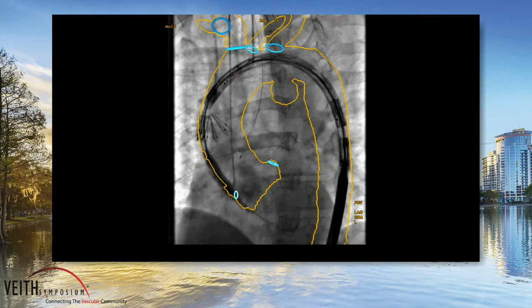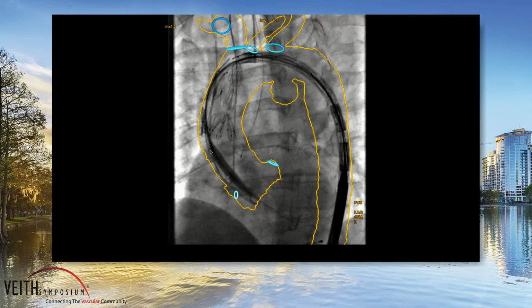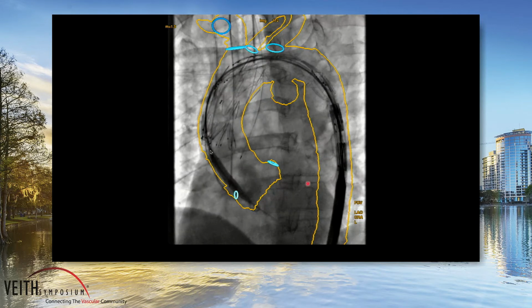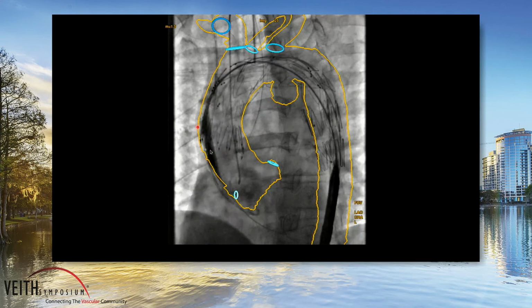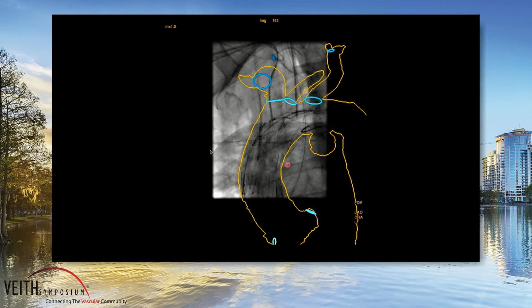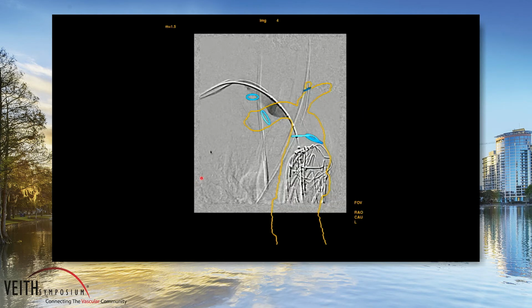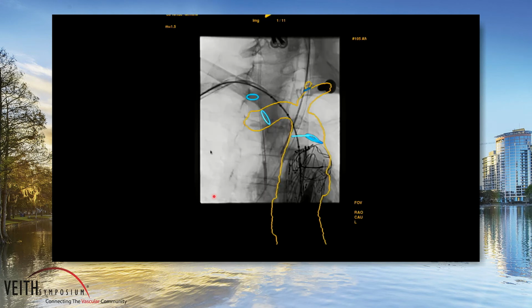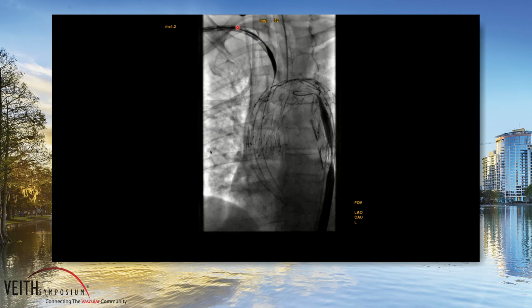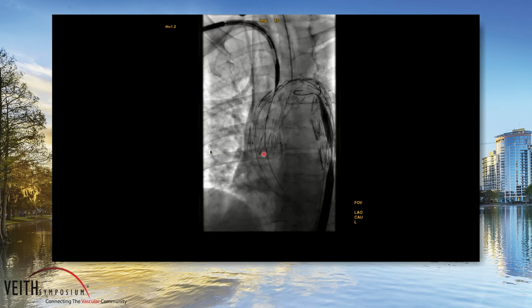A couple of images from such a procedure under rapid pacing. The endograft is released. We perform those procedures in the GE Discovery hybrid room under fusion guidance. Once the endograft has been released, the wire and tip of the delivery system are removed from the left ventricle. Here, from the axillary access, we get into the inner branch for the innominate. Here we're looking at the position of the bifurcation of the innominate from the right axillary, advancing the bridging limb.